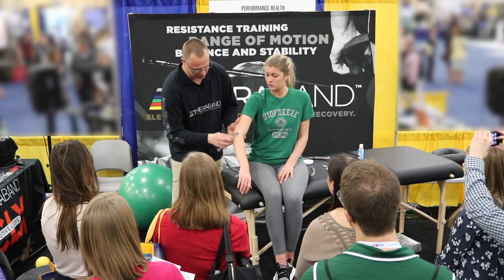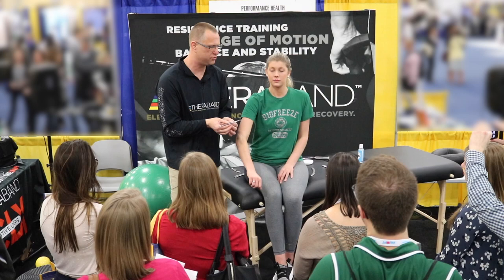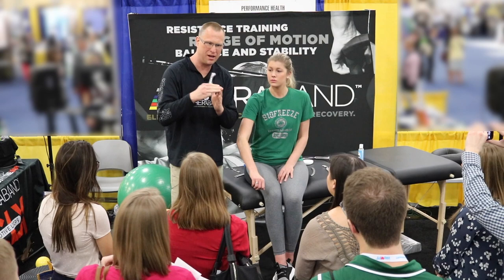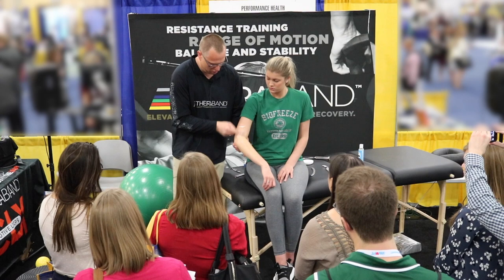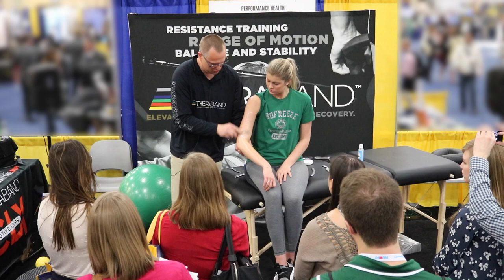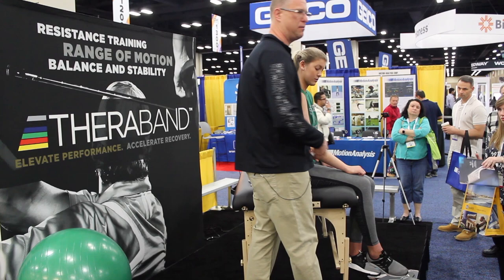For the instrumentation demonstration on lateral epicondylopathy, I apply some emollient directly on the skin — if it looks like we're buttering toast, that's what it is. Every instrument company has options: some have double-beveled edges which are softer and nicer, some have single-beveled edges coming in at a more oblique, abrupt angle. I approach at about a 45-degree angle and work those common extensors all the way up across the epicondyle into where the deltoid insertion overlaps with the brachioradialis and common extensors.